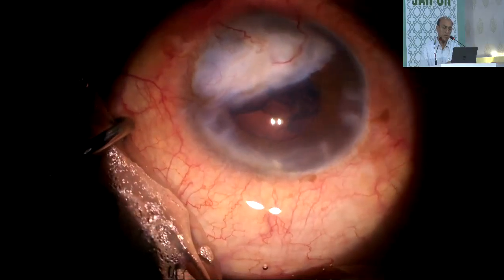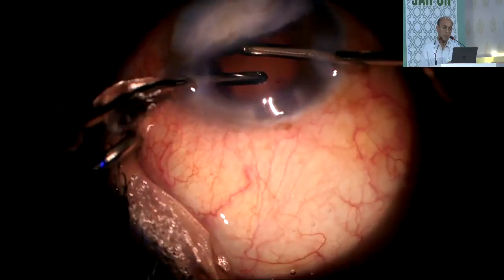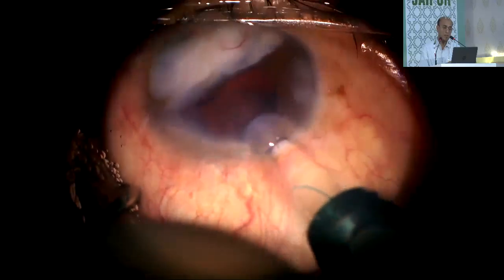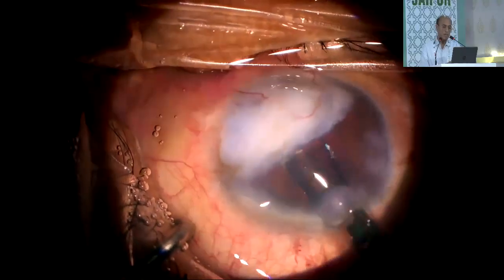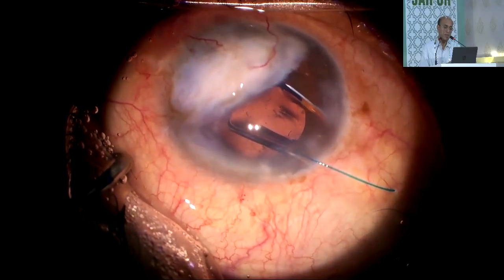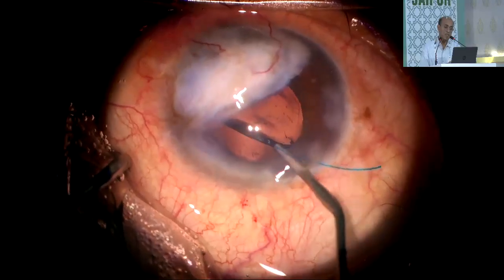With this slower process, we kept putting viscoelastic all the time so that the capsule bag remained inflated and the AC also remained deep. Then we implanted this foldable lens. It was a 3-piece lens so that it goes nicely in the back. We could implant the lens very nicely and there was no problem.